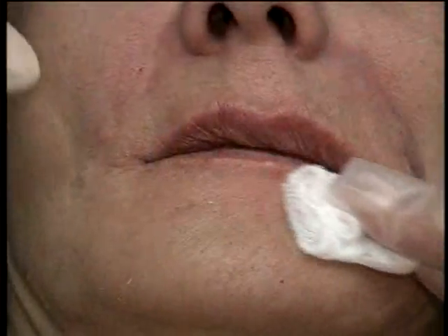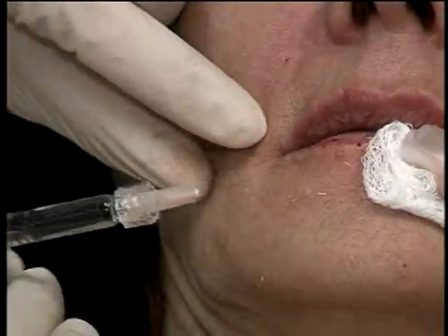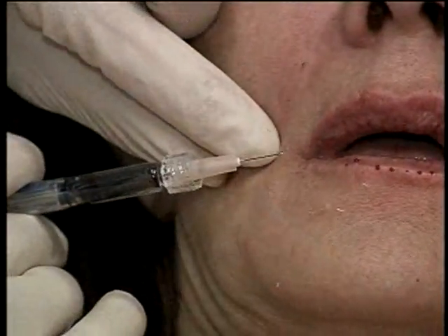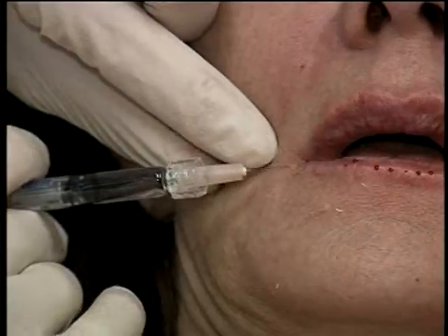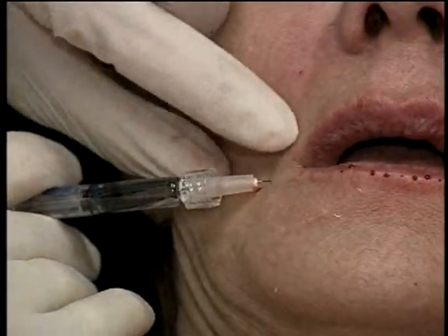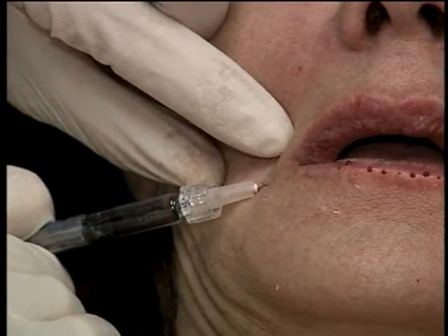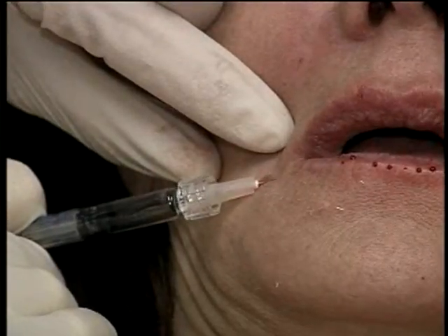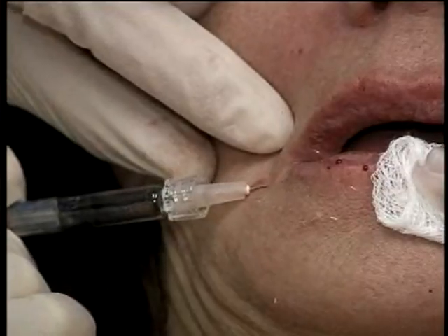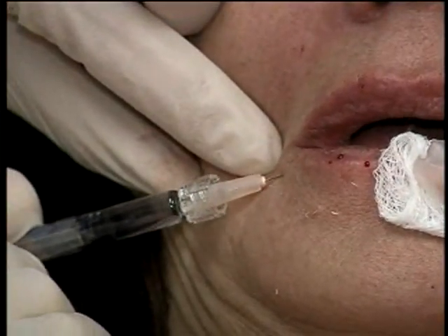Now I'm going to show you a little something I do to raise the corner of the mouth. This is an area where you often have a downturn. So one of the little tips for doing this is I have the patient open their mouth just a touch, and I stick the needle into the oral commissure, but just a little bit below. So I'm just a little bit below the oral commissure, and you can see where my needle is right there. And I deposit product right into the oral commissure, and just a little bit below to support that buttress. And you'll see the corner of the mouth come up right into there.